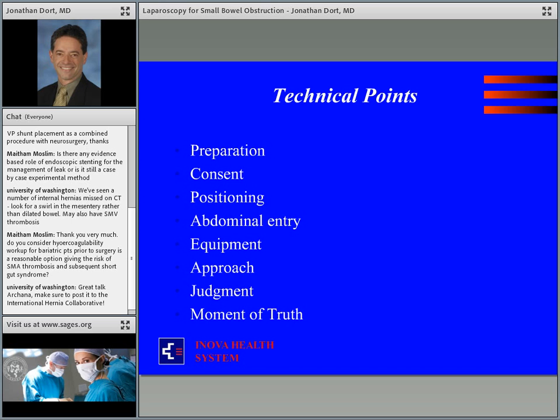But certainly in these situations where there's dilated bowel, there are space issues where that dilated bowel is likely to be close to the abdominal wall with very little space in between. The potential for damage is great. Please consider using open entry for these. Make your incisions away from the scars. I think that makes perfect sense, that the adhesions are more likely where the scars have been. Get in far, far away from them.